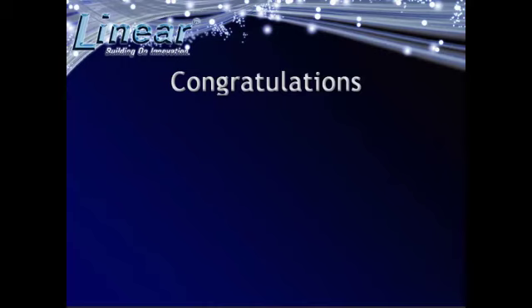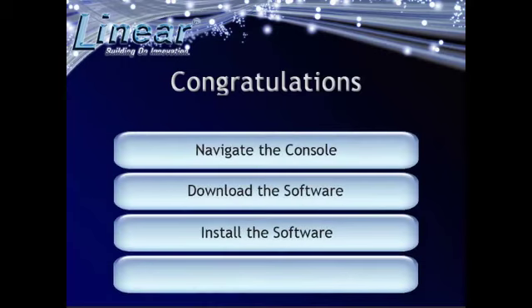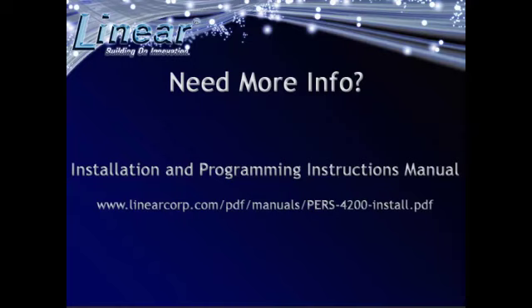Congratulations! You now know how to successfully navigate your console, download, install, and program your new PERS-4200. For more information on the setup and template programming for the PERS-4200, please refer to the Installation and Programming Instructions Manual. An online version is available at www.linearcorp.com.